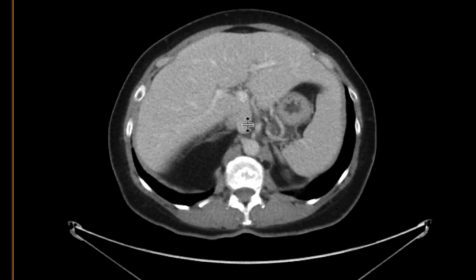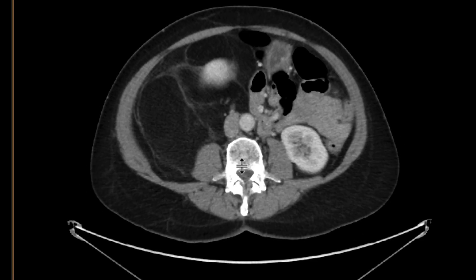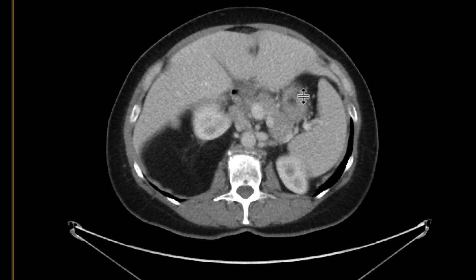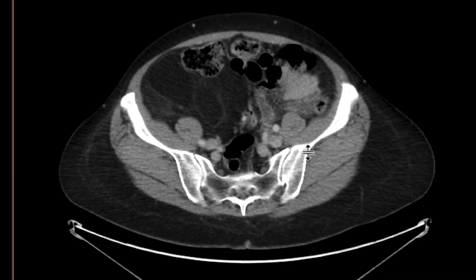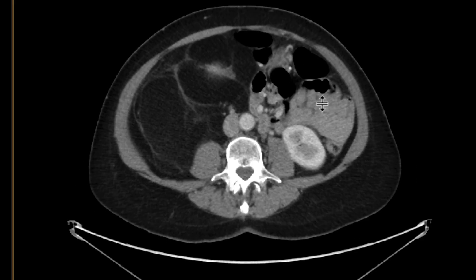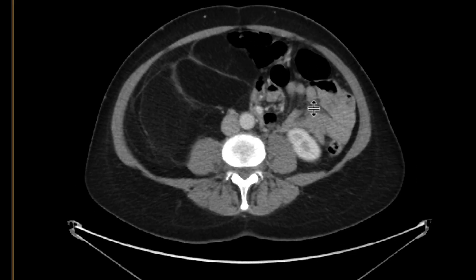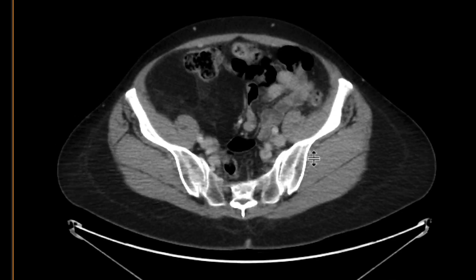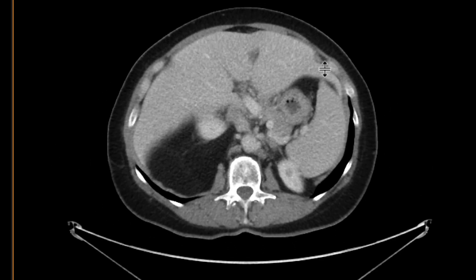Whenever you see this sort of fat-containing mass with some soft tissue elements in the retroperitoneum, you have to think about a liposarcoma. Liposarcoma is the most common primary retroperitoneal neoplasm that you'll end up seeing. It will often not respond to radiation or chemotherapy and would require some degree of resection, but outcomes are generally poor with recurrent disease often occurring in this setting.